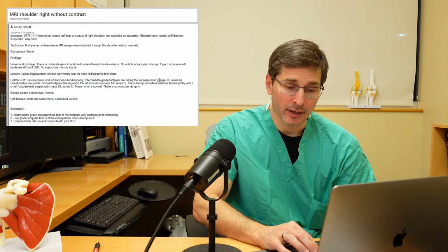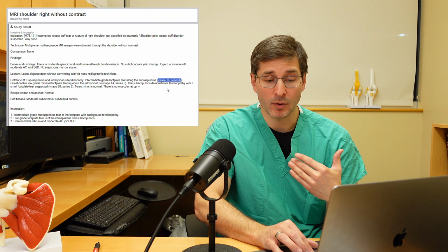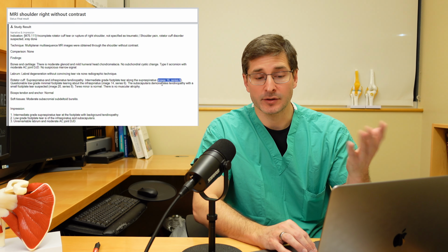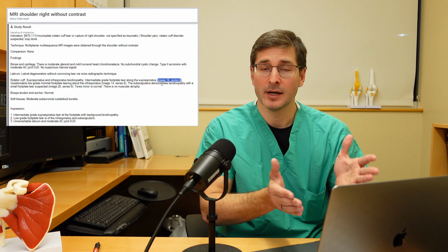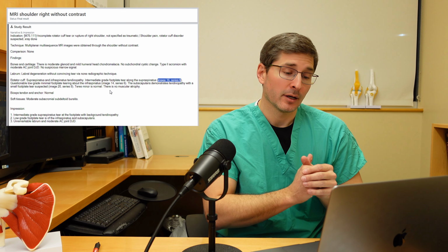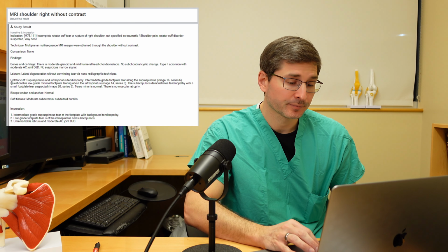And then sometimes they'll put a location of where they see it. And so in this one, this is image 16 out of series 6. And so that just refers to the actual image, so I can specifically go back and look myself at what they're seeing.